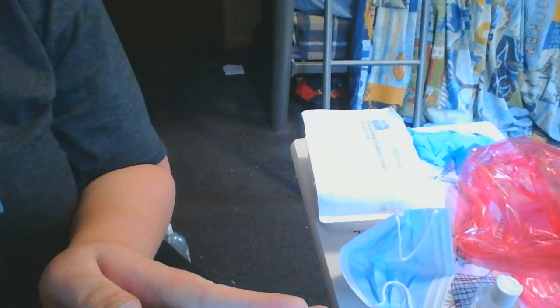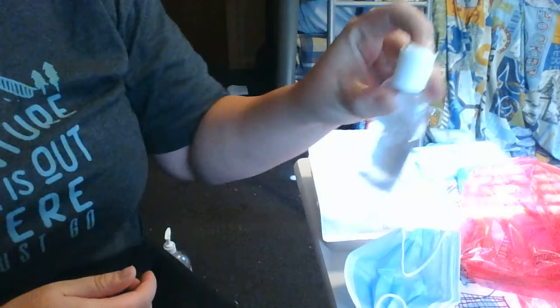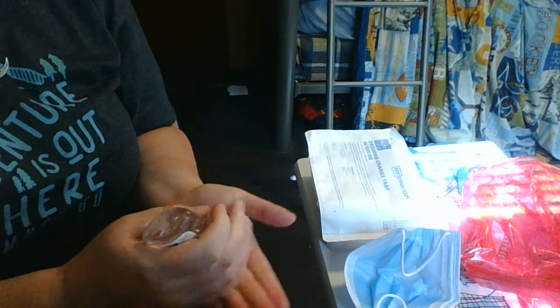So I do have a little table set up to my left with all the things. So I'm going to go ahead and do my hand hygiene, put on a mask.